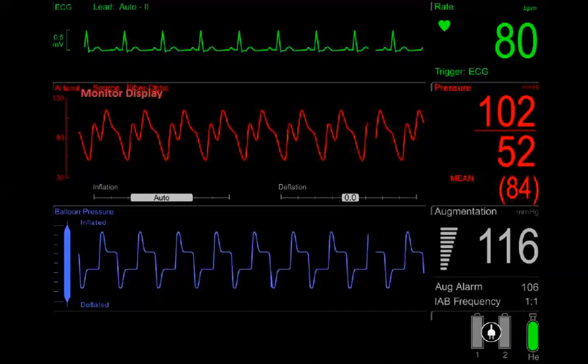أنت الحين برضو اللاين اللي تقراه هل هو اللي أنت قاعد تقرا من البالون ولا قاعد تقرا من الراديال؟ لأنه يعني في اختلافات، لكن غالبا راح يكون نفس بعض. I was saying if you're reading from the femoral مثلا.